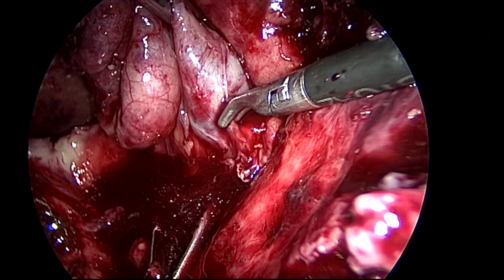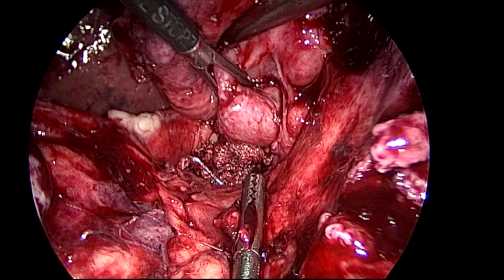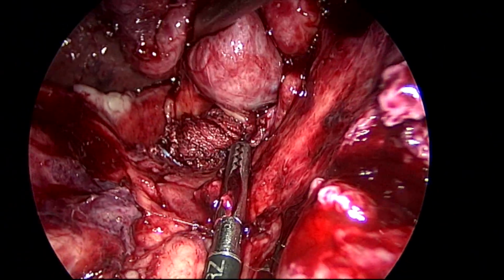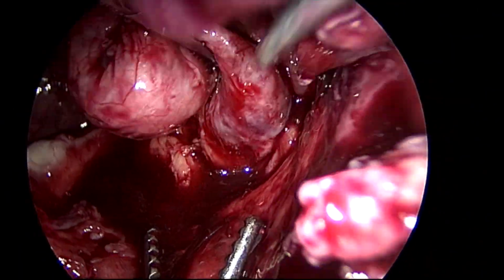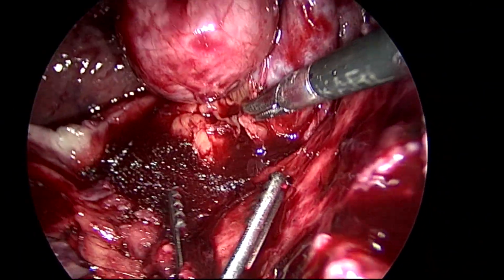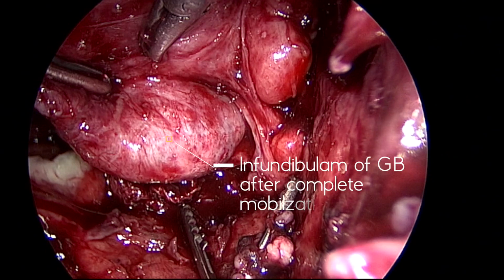Simultaneously, posterior and anterior, I am doing it now. Now you can see it is coming out. It might be a stone that is there, and that is the infundibulum. Once the infundibulum is coming out, you are able to see the duct and artery very well. So after that, the infundibulum is complete.